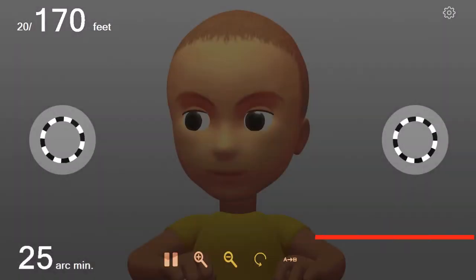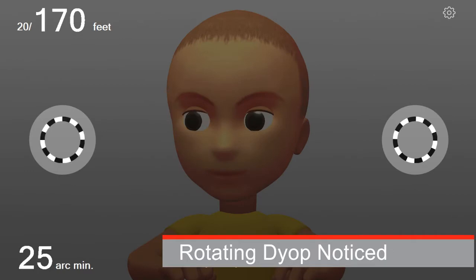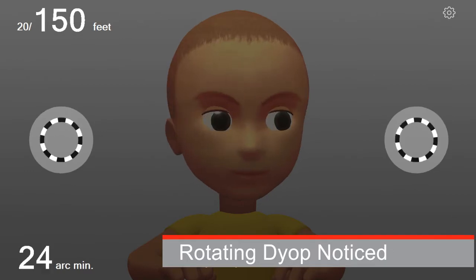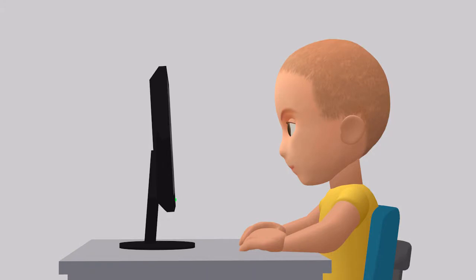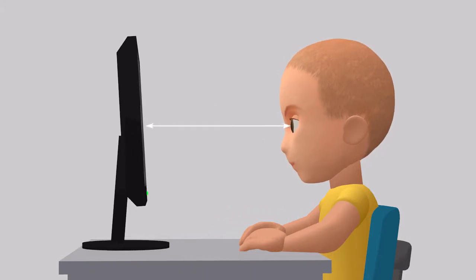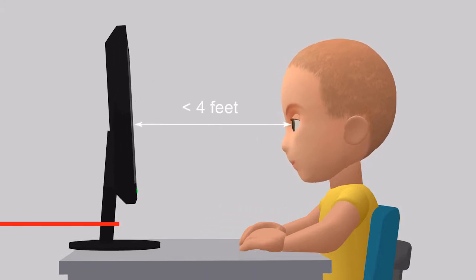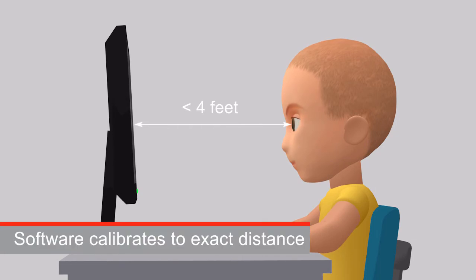The typical response is to notice the one which is rotating rather than the static DIOP. The child should sit close enough to the monitor — approximately 3 feet or less — to ensure the head or eye movements noticeably change when tracking the location of the spinning DIOP.